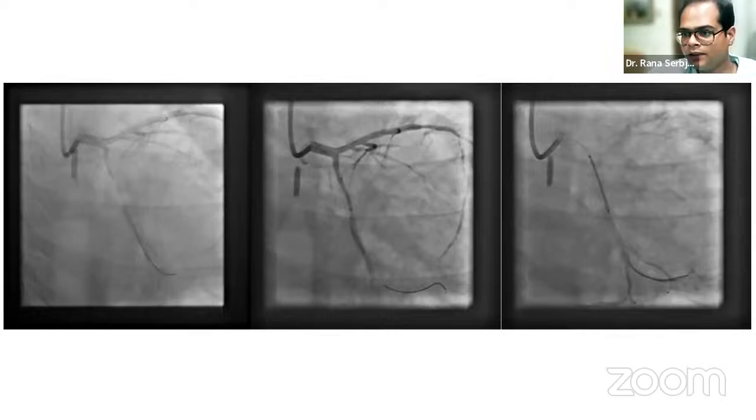If I can ask, how has the MR developed in that patient in the first place, if you are in follow-up with the patient? Yeah, actually, in the first case, the LAD was compromised and even the right coronary artery was compromised. Whenever LAD and RCA both get compromised, there is significant MR. And as I mentioned at the last, after stenting the right coronary artery, that PLV was very big. It was a super dominant kind of RCA. So that was the reason for involvement of the mitral valve apparatus. How is the MR after follow-up? MR decreased to less than moderate on day 3 itself. That was acute MR, secondary to ischemia. Yeah, it was an acute MR.